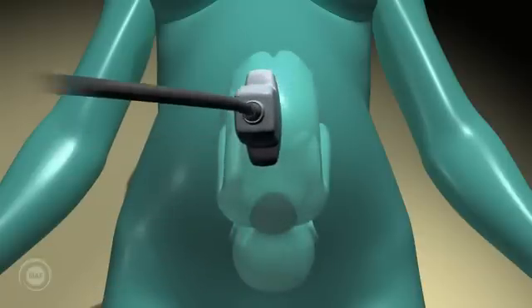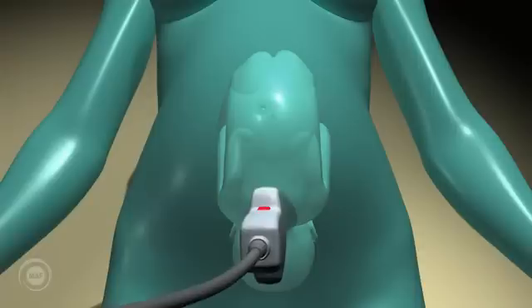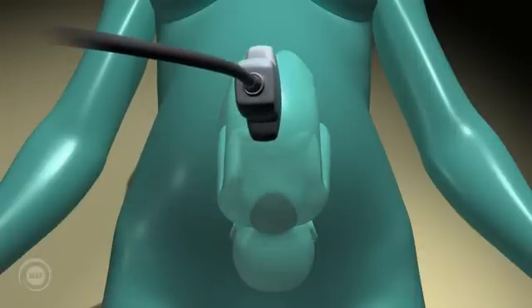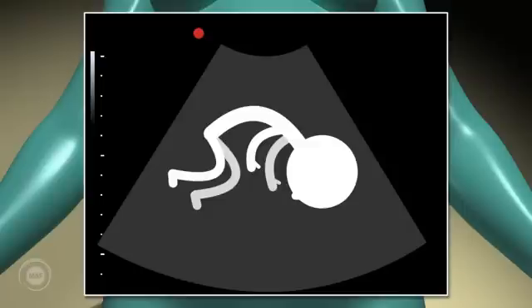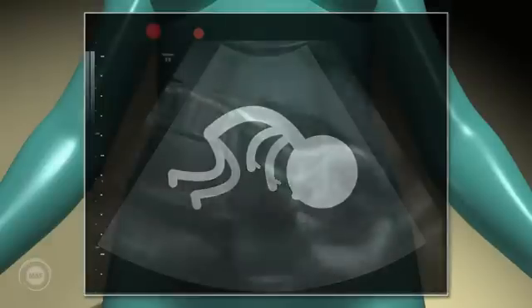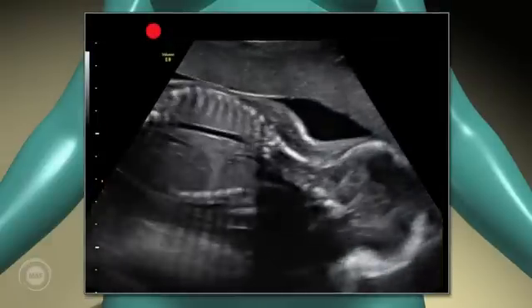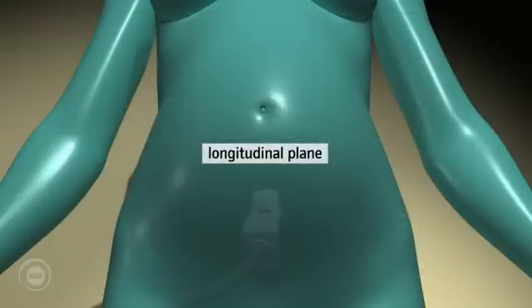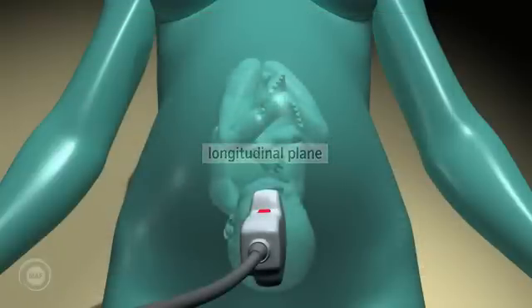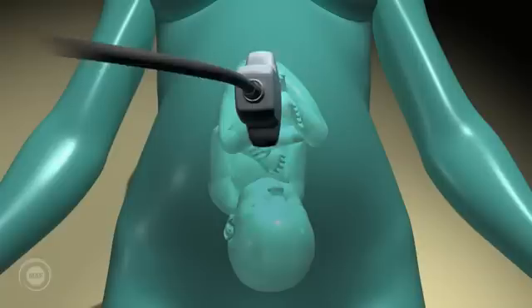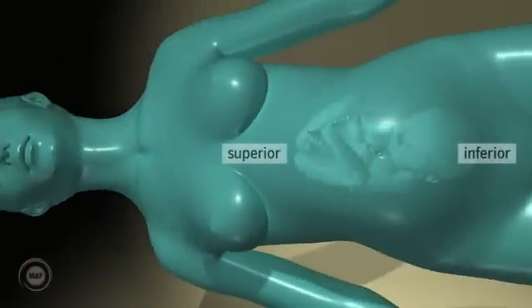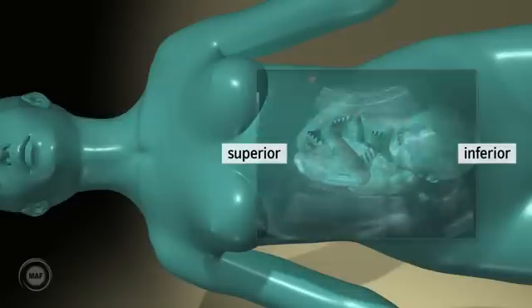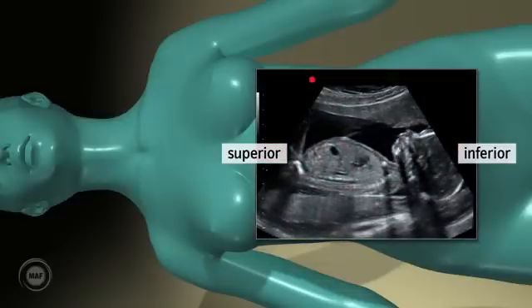The head will be to the right of the screen and the fetus's back will lie at the top of the screen. To summarise, when scanning in a longitudinal plane, the right side of the screen always shows the inferior part of the mother, and the left side of the screen always shows the superior part of the mother.